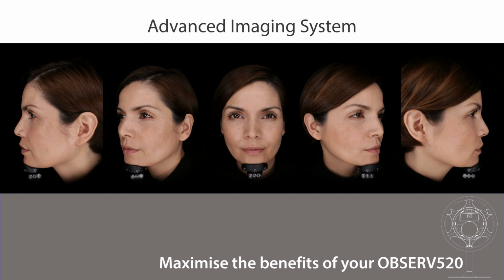The different side views, in addition to the frontal views, not only allow you to create a global overview of the skin, but also allow you to accurately capture what is not always visible in the frontal view.